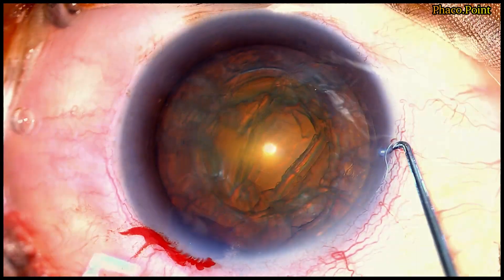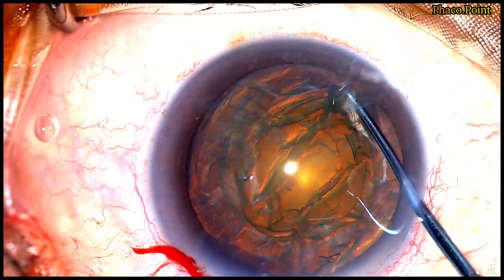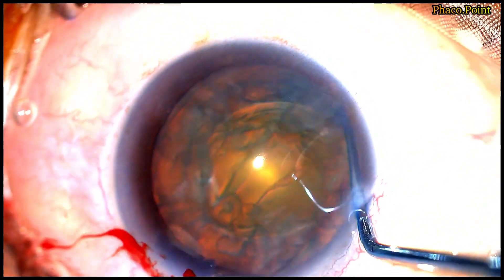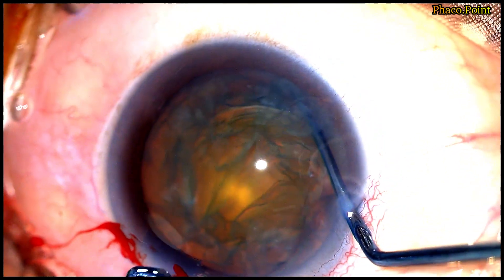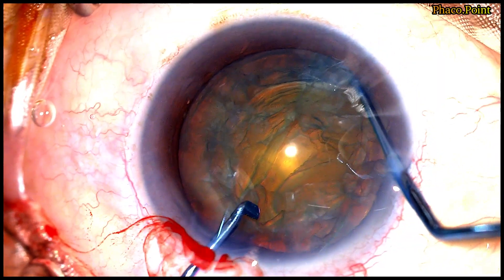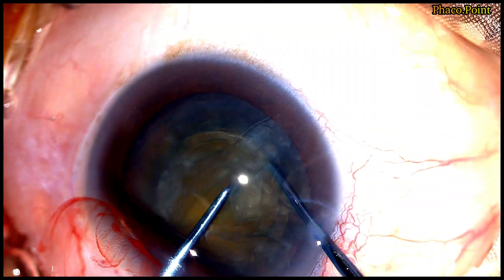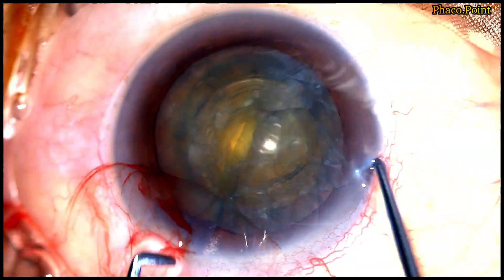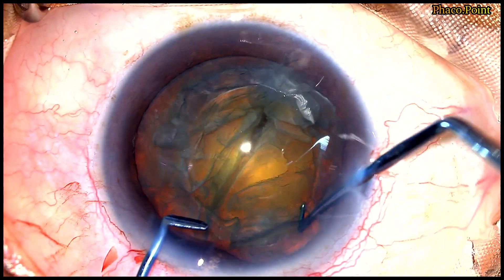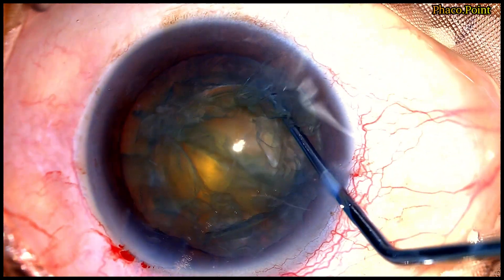Because I'm left-handed, I use the sustainer — the hooking instrument — in my non-dominant right hand. See how I hook onto the endonucleus; I can actually see the tip beyond that very soft cataract. Having hooked and stabilized the nucleus, the second instrument — the pre-chopper with its anterior cutting edge — buries into the nucleus and both instruments are drawn towards each other, after which they are laterally separated, resulting in a successful and effortless nucleus disassembly. Let's now watch the division of the heminuclei into smaller fragments with this same technique.